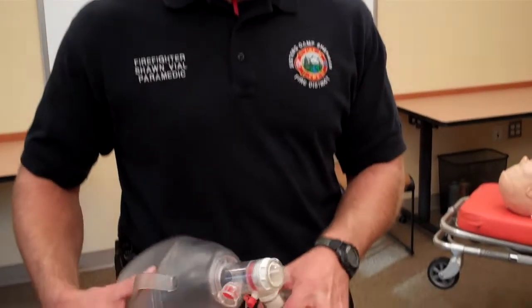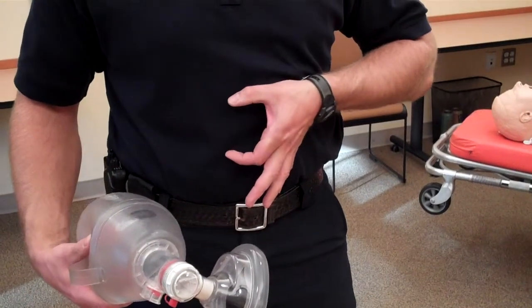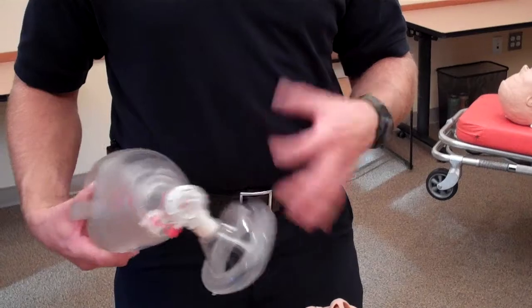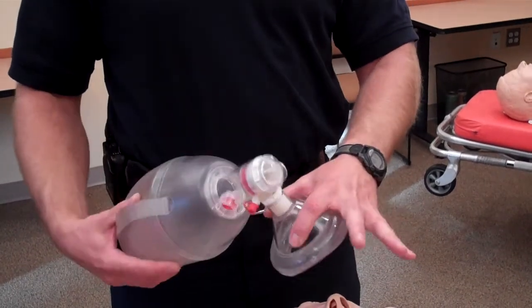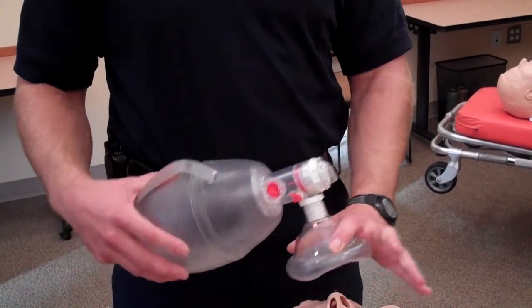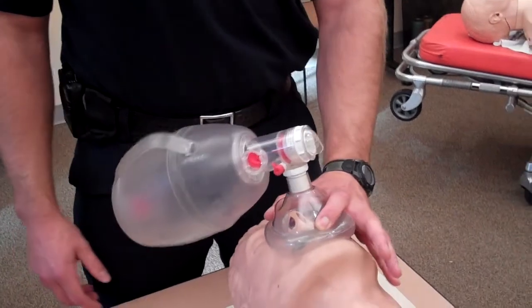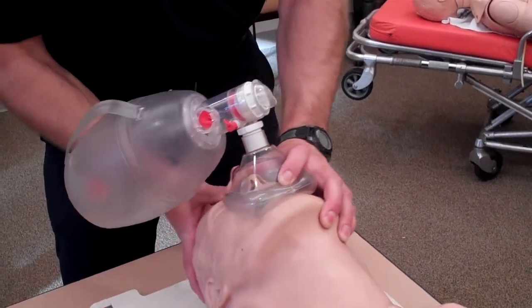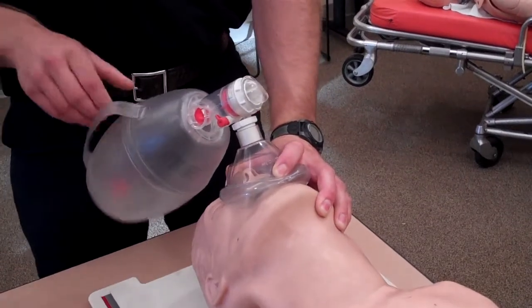Most people are trained using the CE technique, which is to form basically the letter C with your thumb and forefinger and then the letter E with the other three fingers. Grabbing the mask with the thumb and forefinger, placing the mask over the patient's face, and tightening. They usually do a head tilt, chin lift on the mannequin and begin ventilating.